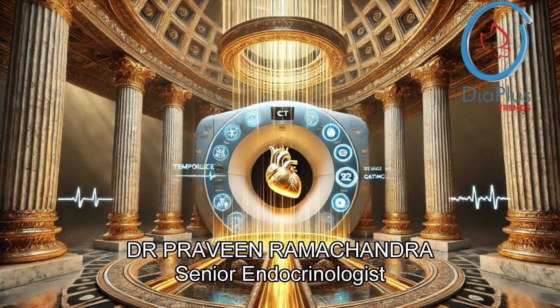The document also talks about Z-axis coverage. Wider coverage means capturing the whole heart in one go. So fewer scans, less time in the scanner. It's good for everyone. Less radiation. Exactly. And speaking of patient comfort, the document really stresses radiation dose optimization. That's a big one for a lot of people, myself included. They talk about things like tube current modulation, which adjusts the X-ray intensity based on the patient's size and the area being scanned.